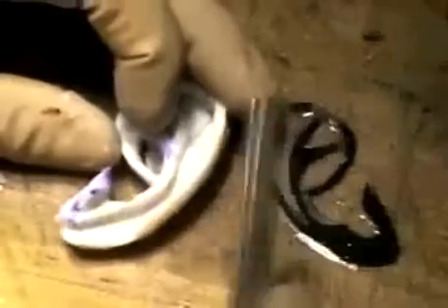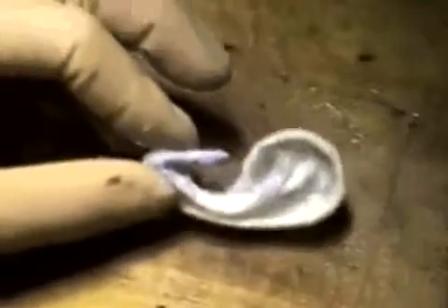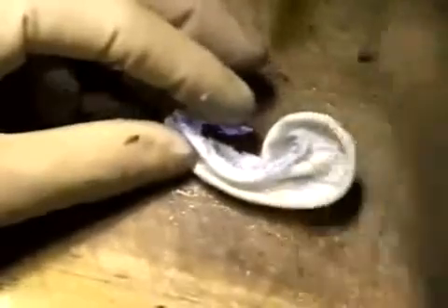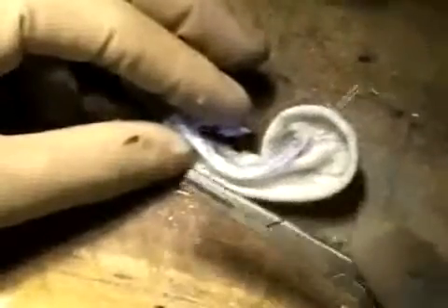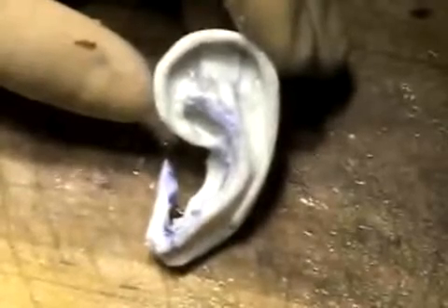The final process is to create the concha. A small piece of cartilage is fabricated into the cymba concha. Another small piece of cartilage was fabricated into the cavum concha. This is the completed three-dimensional ear framework.